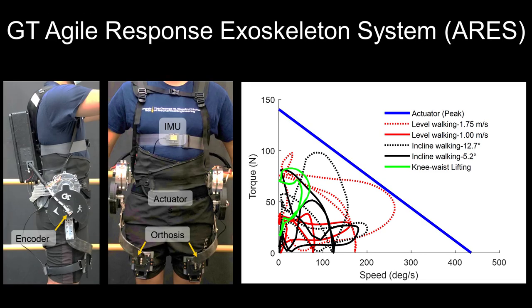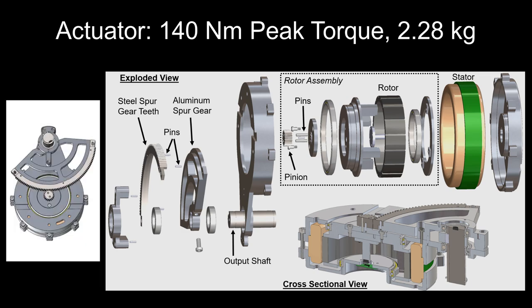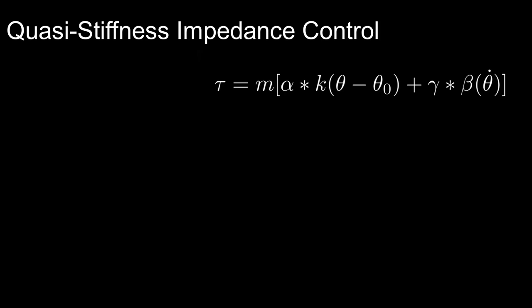We design a powerful and versatile quasi-direct-drive hip exoskeleton to assist in both lifting and ambulation. The in-house fabricated actuator is built around a frameless motor to achieve high specific torque and high peak torque. The actuator features a partial spur gear composed of steel teeth and aluminum framing to reduce weight. The type of controller employed for all tasks featured in this work is quasi-stiffness impedance control.